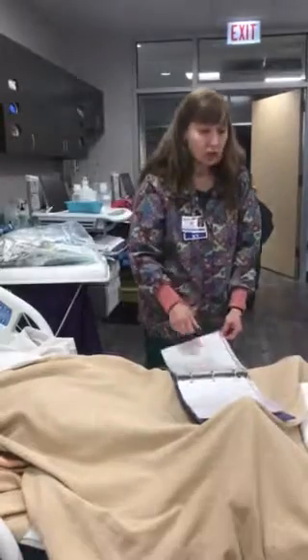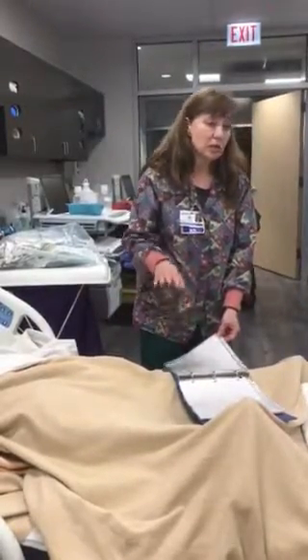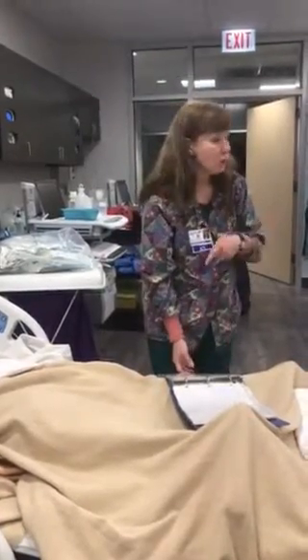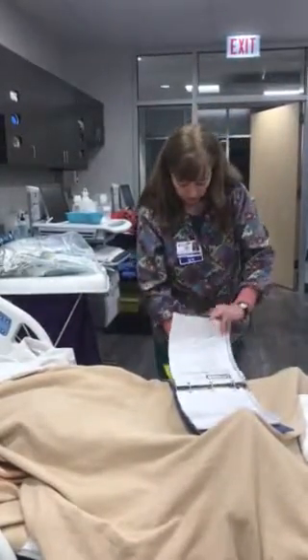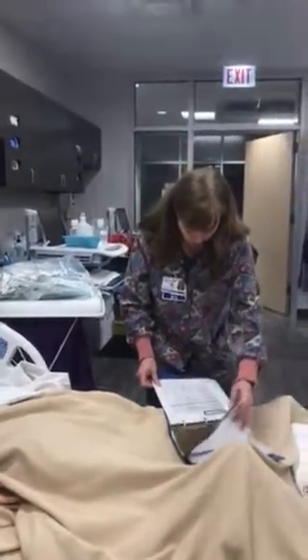Now with the irrigation, you always give free water, and it's not on the order sheet. Normally it would be on the physician's order sheet. So we're going to give 100 milliliters of water. You always want to give your patients free water because otherwise they get dehydrated, and you don't want that to happen. So we're going to go ahead and pull up the MAR.